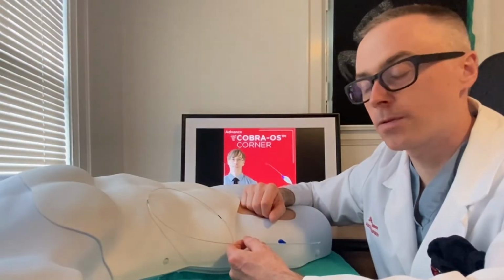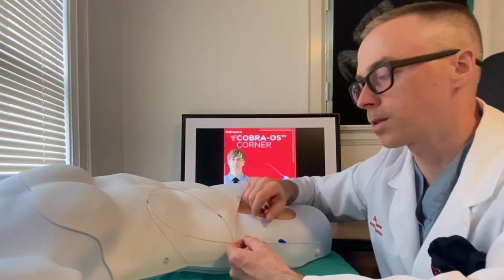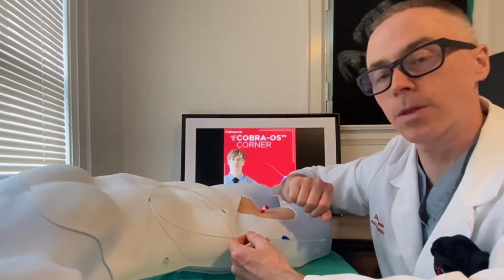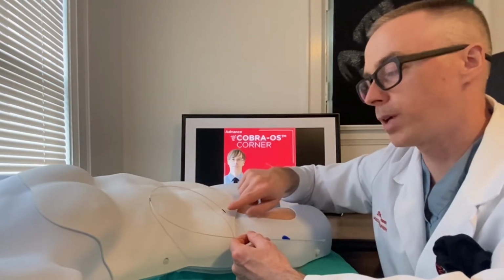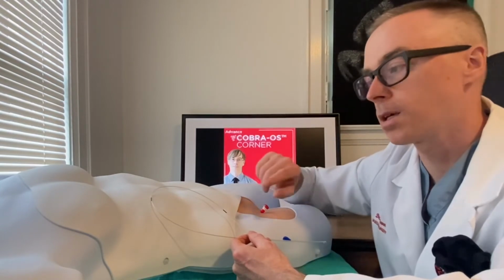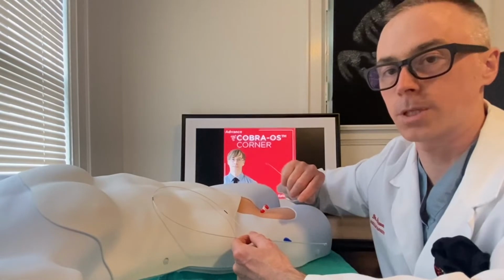The COBRA-OS device has two external markers to help you with positioning and placement. There's a Zone 1 marker with a single black mark and a Zone 3 marker with 3 black marks. If you advance to the Zone 1 marker, you will be at 48 centimeters from the sheath, while the Zone 3 marker brings the balloon to 28 centimeters from the sheath.